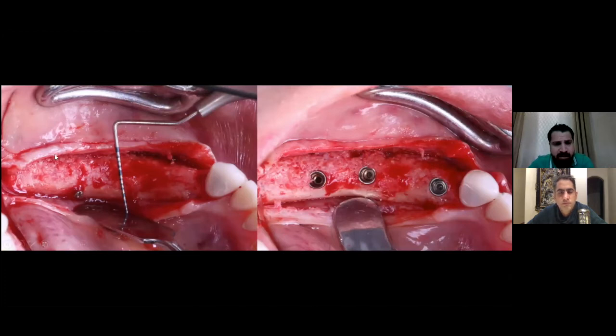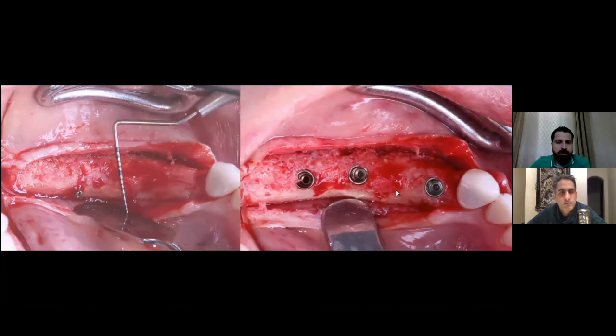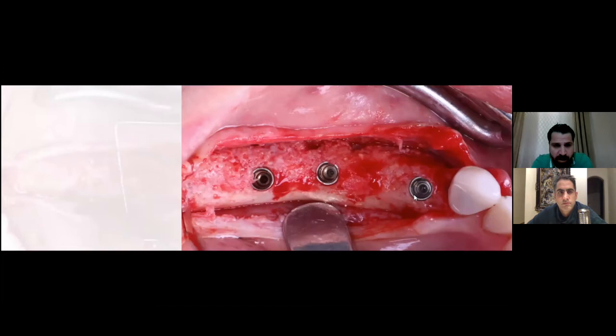Here I had a slight resorption. I had a slight resorption on this one as well. We removed the tenting poles, removed the screws, placed my 3 implants, size 4.1, that was Straumann, I remember. And I think this is enough for us.